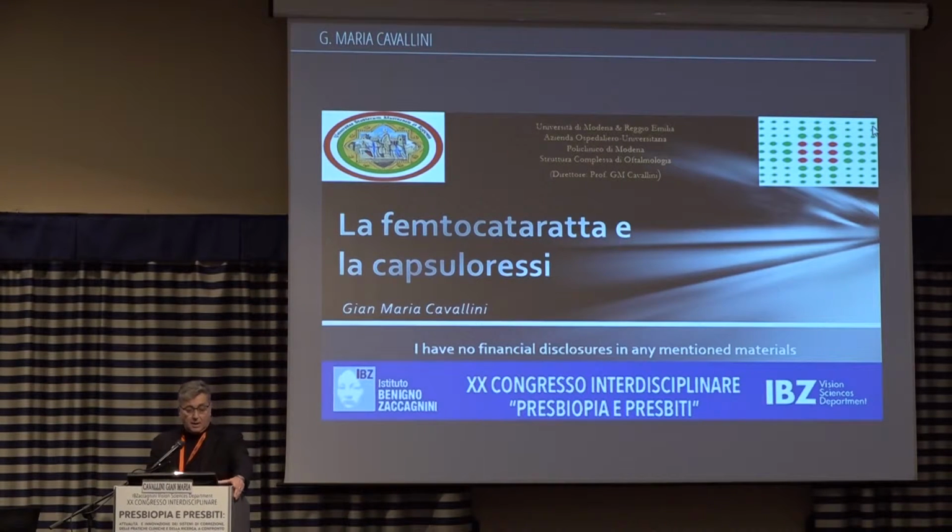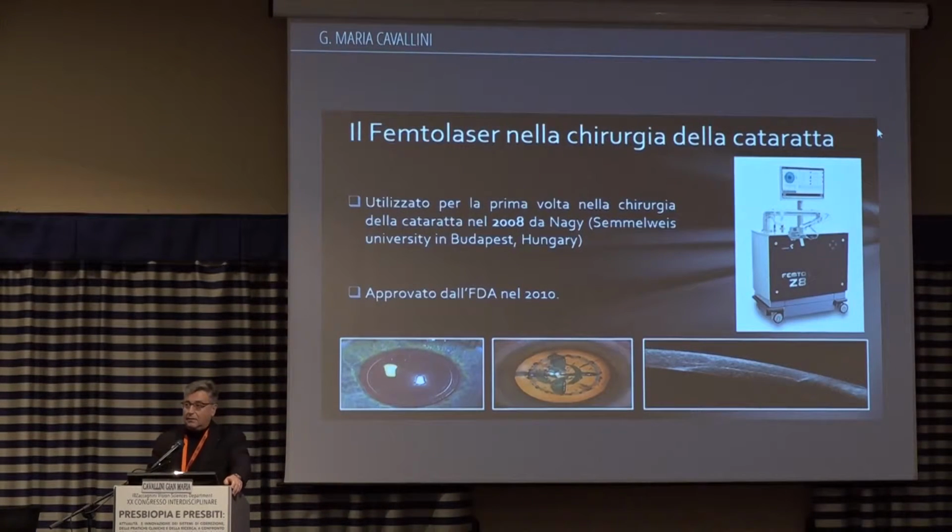Femtosecond cataract surgery and capsulorhexis, which is a very important step in cataract surgery, affecting the refractive outcome and the effect of a multifocal or monofocal lens.